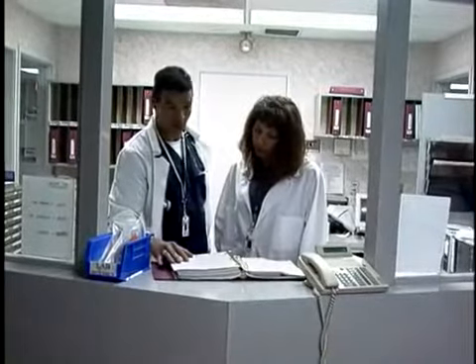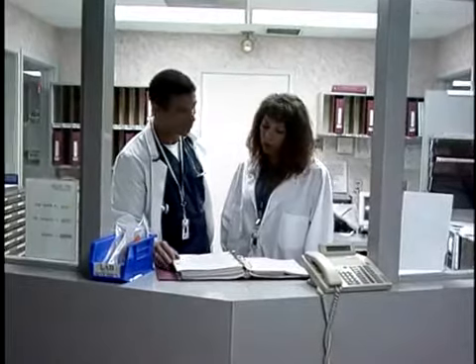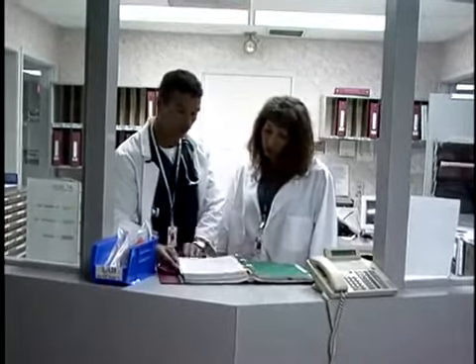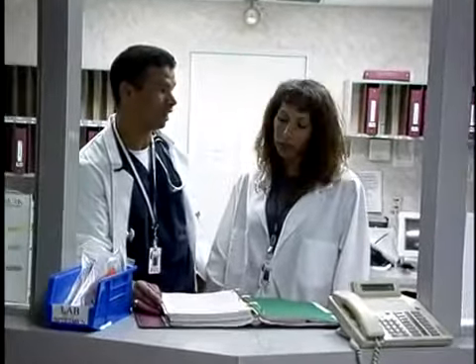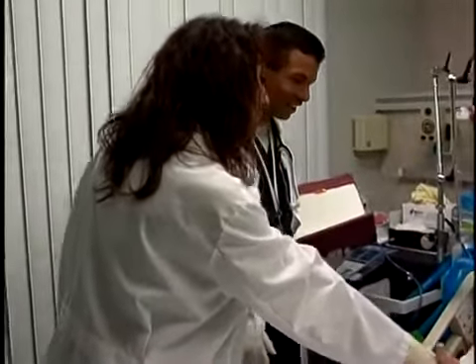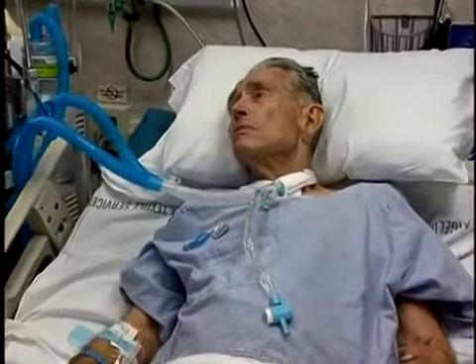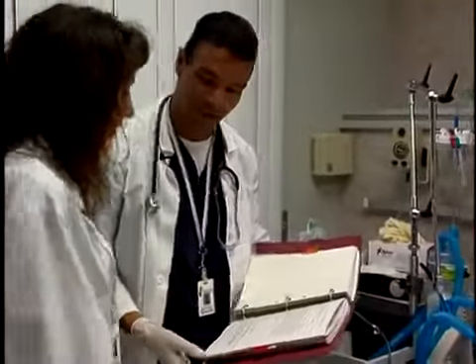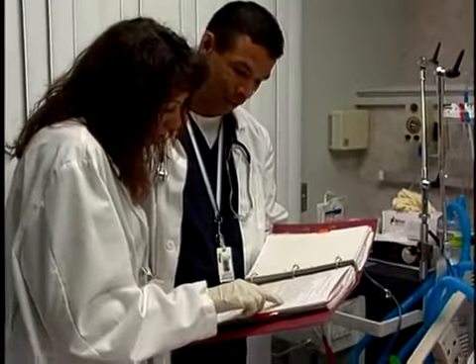Placement of the Passy-Muir valve with a ventilator patient follows the same assessment criteria as the tracheostomized patient with some additional criteria. Obtain baseline parameters, as this provides the clinician with a starting point for ongoing assessment during valve trials. It is important to obtain your patient's history, especially information such as diagnosis, bronchoscopy reports, and arterial blood gas results when available. Of primary concern will be indicators suggesting reduced airway patency from repeated intubations, vocal cord paralysis, or other diagnoses.